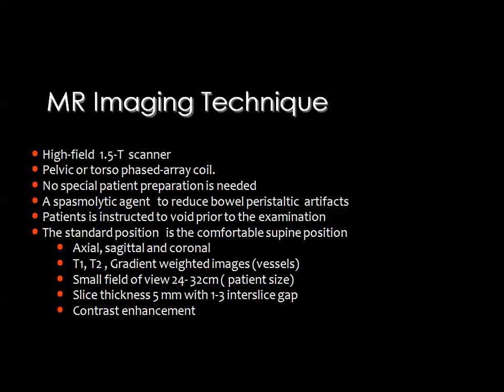And the usual examination technique is performed by one of the high field scanners, and we use one of the pelvic or torso phased array coil, and there is no special bowel preparation needed for MRI except that you may inject some spasmolytic agent to reduce the bowel peristalsis to avoid some artifacts.